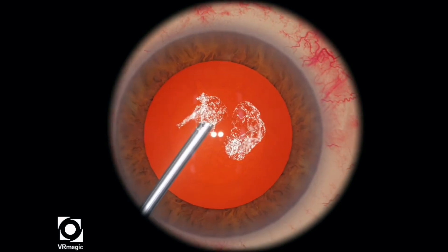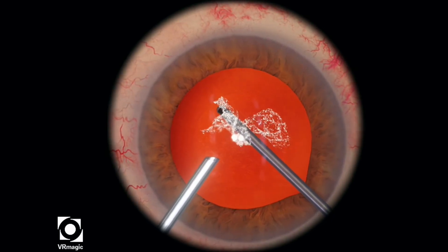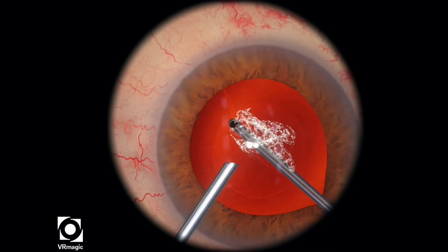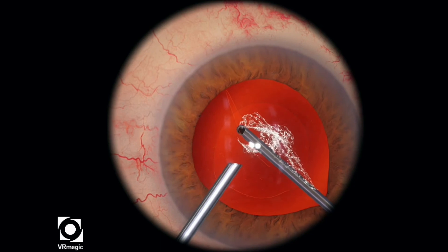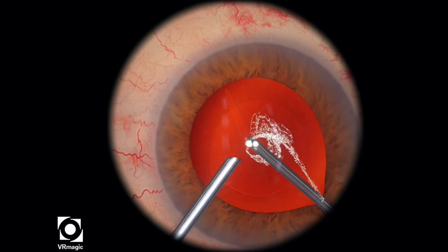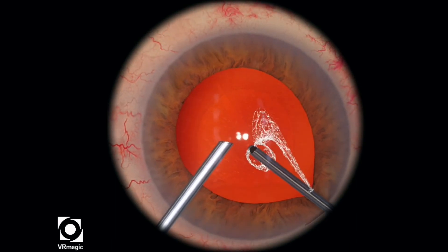Let's take a look at that one more time. Start off with the irrigation handpiece first, start off at the very bottom — so behind the posterior capsule — and then start cutting. You want a relatively high cut rate; I usually set mine at about 2,000. So you're cutting really quickly.